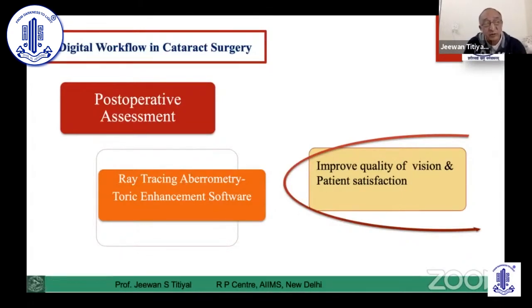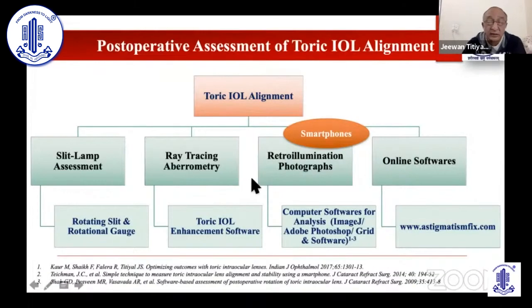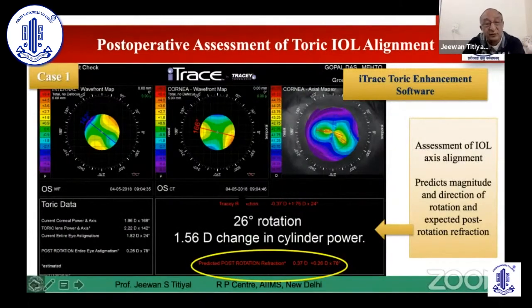What about digital workflow in the post-op period? That is basically looking at ray tracing aberrometry and toric enhancement software, which can also improve the quality of your assessment of post-op cases, especially with toric IOLs. So this is what we use, iTrace, to look into our patients.